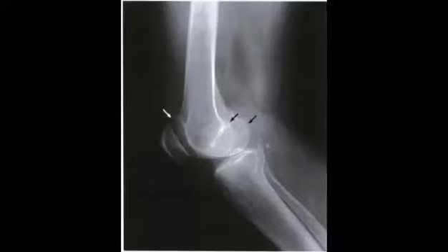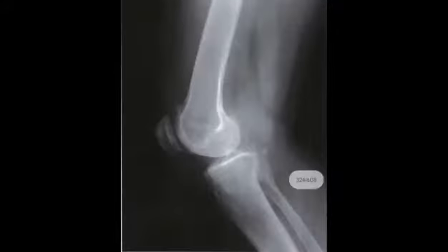This image is an improperly positioned lateral knee. Note the condyles are not superimposed and the patella is close to the joint. This second picture is the same patient as the image earlier after correct positioning. Condyles are superimposed and the patellofemoral joint is open.